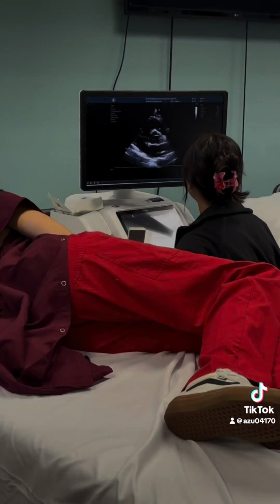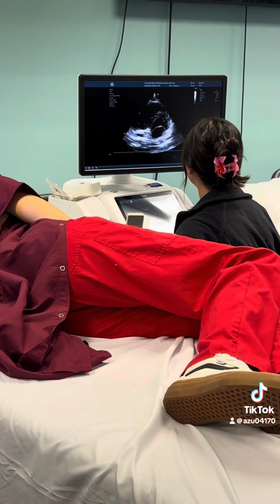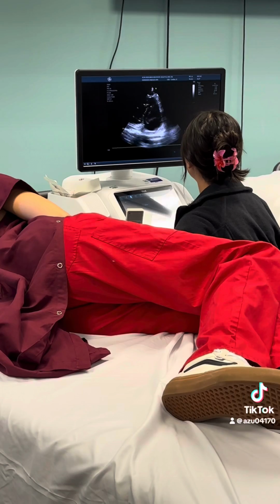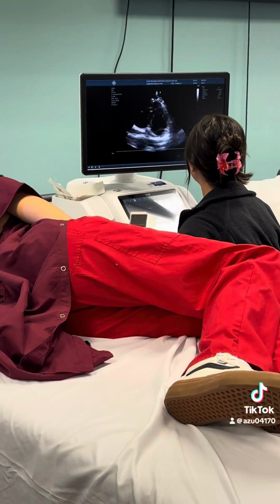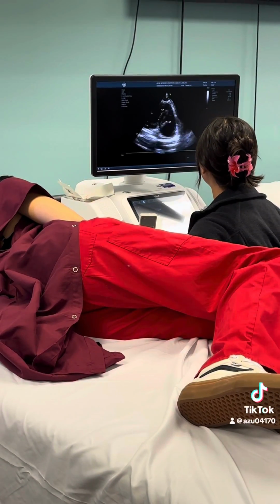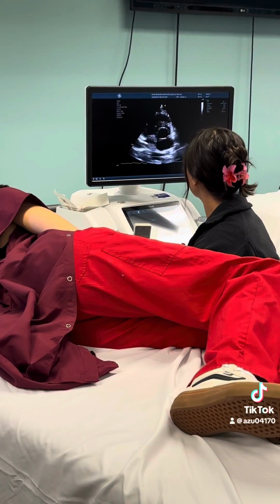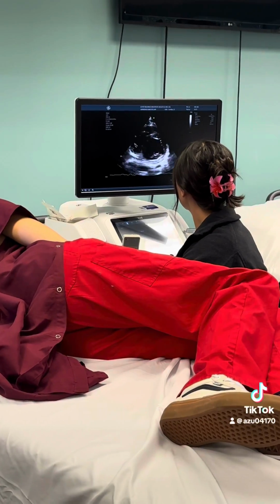For this view, you don't want to move your probe. You just want to tilt it slightly inferiorly to get the mitral level. And in this level, you can see the mitral leaflets, the right ventricle, the interventricular septum, and the left ventricle.